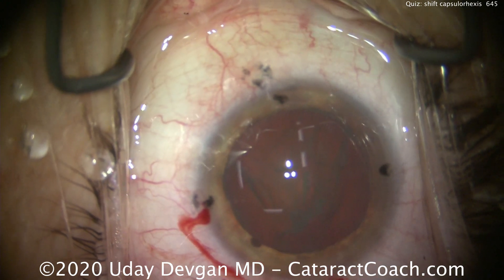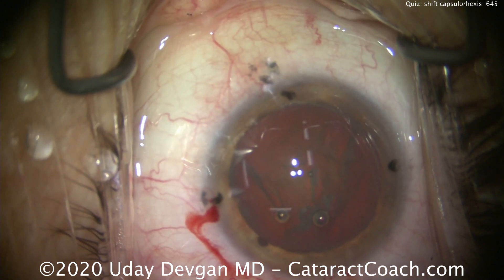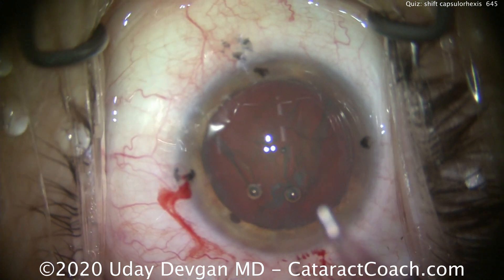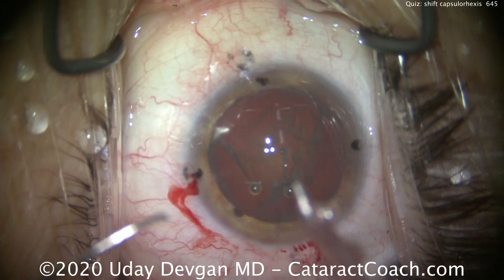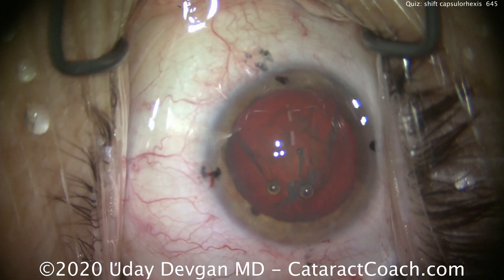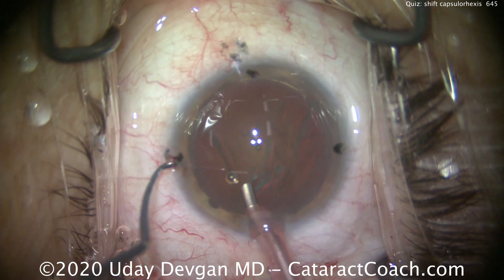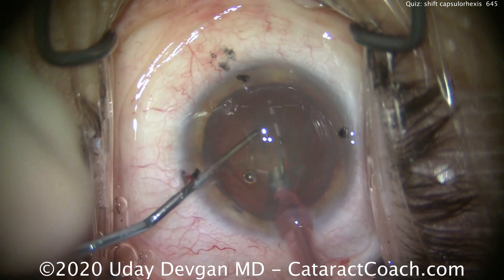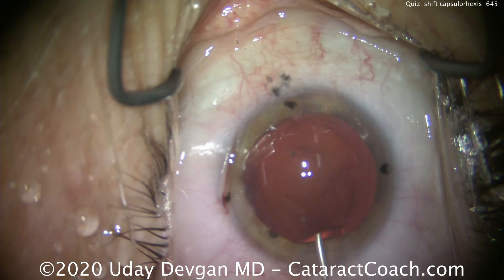So we'll do this as a routine case, and you're going to find out at the end that this capsular axis is very appropriately positioned. The answer to the quiz is: we've nasally decentered this capsular axis in order to center it on the patient's visual axis. And you can imagine, if we're putting in a lens that has diffractive rings — like a multifocal or trifocal lens — we want to have that lens beautifully centered.